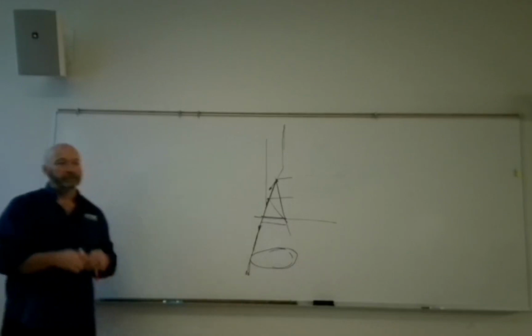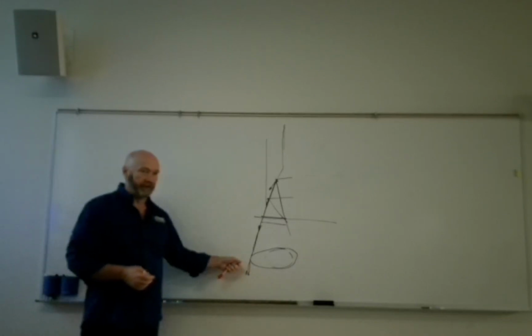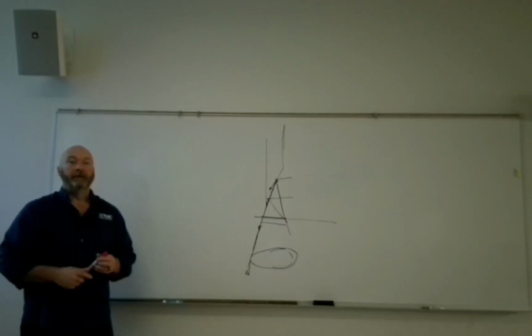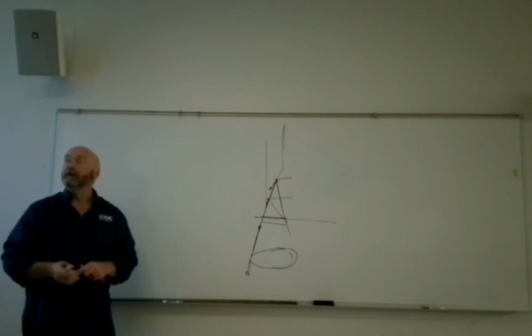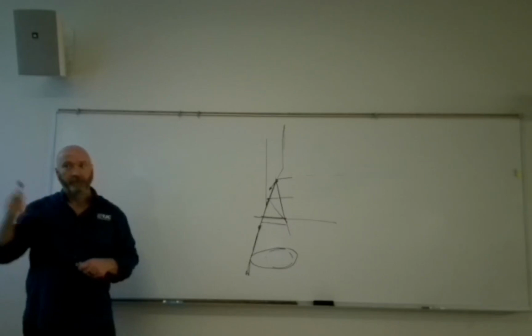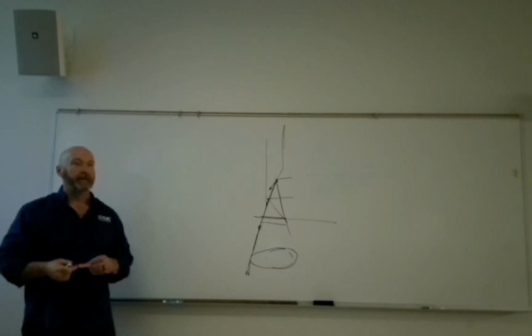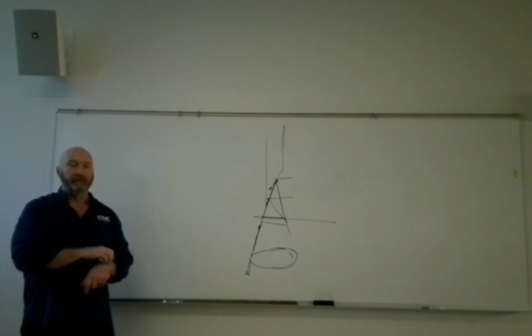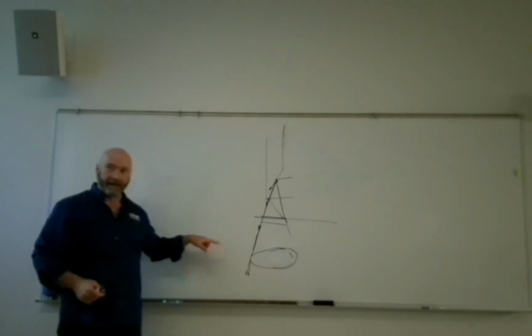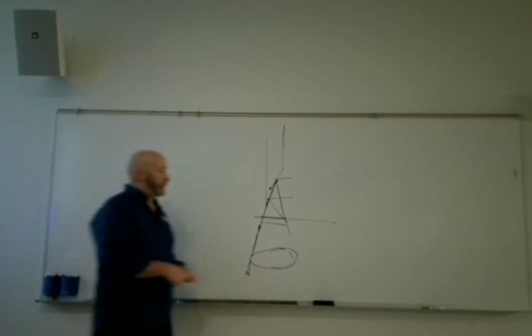So what do we call that? Double shadow, loss of sharpness at the edge of an anatomy. What do we got a word for it? It's focal spot blur. We got another word for it. It sounds like what you would need today because it's a rainy day. Penumbra. It's penumbra. Umbra is sharpness. Penumbra is unsharpness. So that is your penumbra on the anode end of the X-ray tube, right?